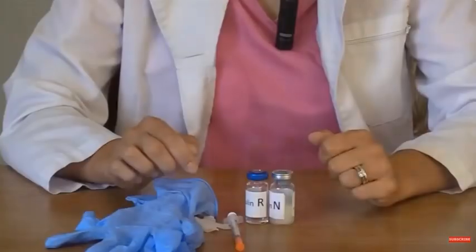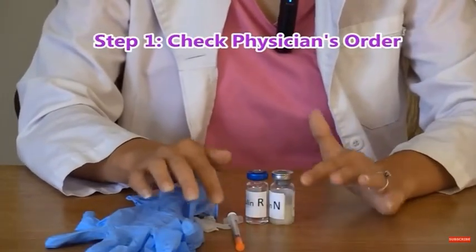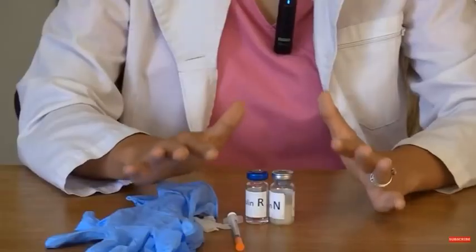Now I'm going to show you how to actually mix insulin. Now this is just an example. Always follow your hospital protocols and your doctor's orders, because procedures and medications do change over time. The very first thing you want to do is check your physician's order to confirm how much insulin you're actually giving.